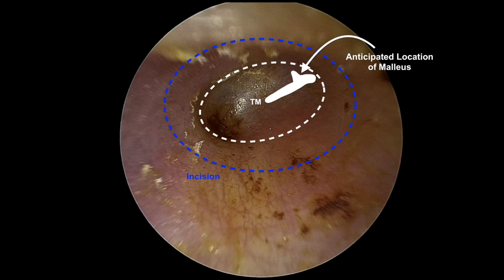Here we have an initial endoscopic view of the left ear canal with no visible tympanic membrane, as it is overgrown by ear canal skin resulting in stenosis and hearing loss. The white dashes represent the outline of the TM and the anticipated location of the malleus is indicated. The blue dashes indicate where we will eventually make our circumferential incision.